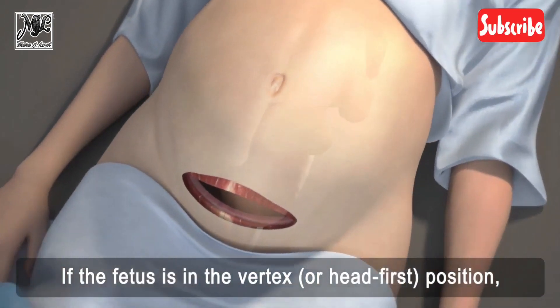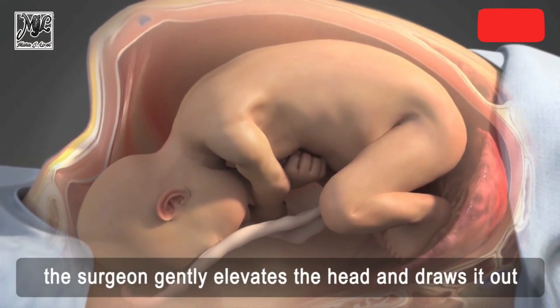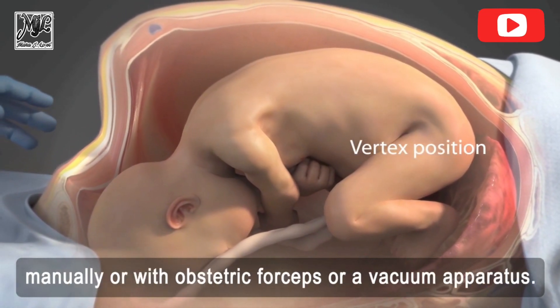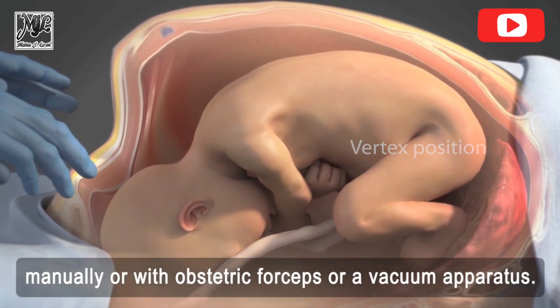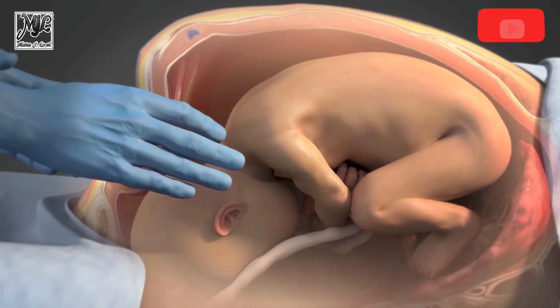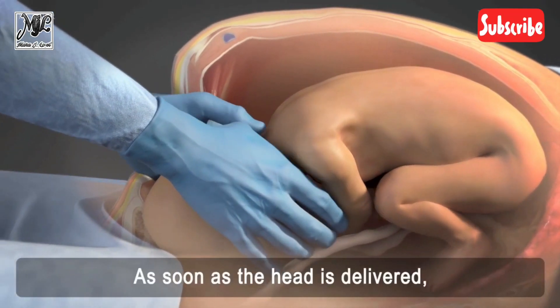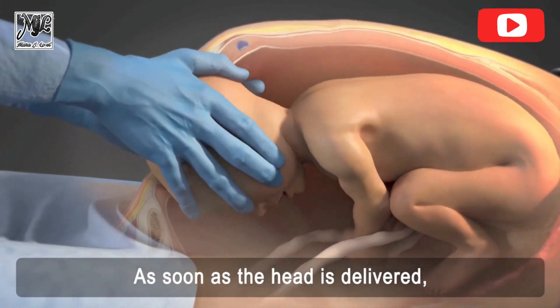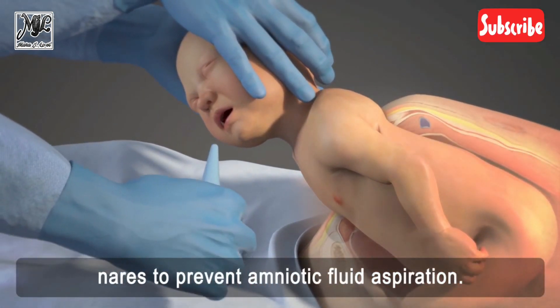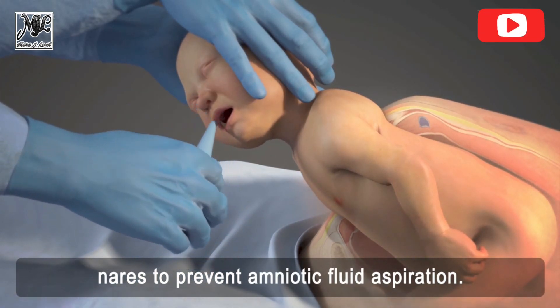If the fetus is in the vertex, or head-first position, the surgeon gently elevates the head and draws it out manually or with obstetric forceps or a vacuum apparatus. As soon as the head is delivered, a surgical assistant aspirates the infant's mouth and nares to prevent amniotic fluid aspiration.